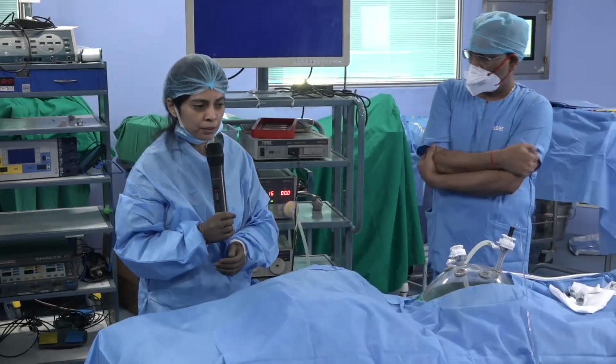Yes, Dr. Meena, several studies have been published showing that if you do a setup like this and are careful, contamination is minimal. But if you are doing repeated PIPACs in lots of patients, there is a possibility of the team being affected over a period of time, which we definitely want to avoid.